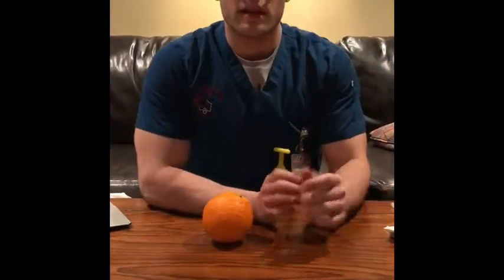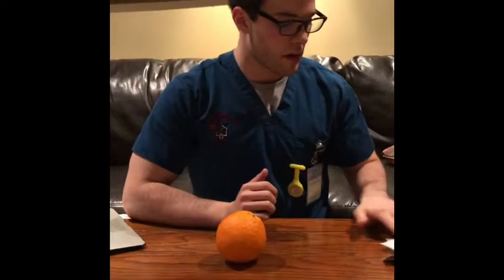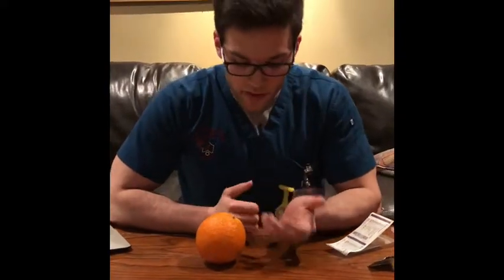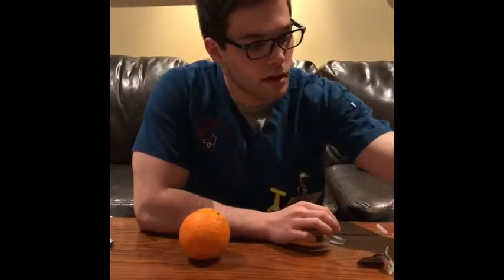But once again, I would do hand hygiene and put on gloves, and then I would start by coming into the room and then ensuring that the patient's ID matches up with whatever is written on the medication and what the MAR says, Mr. Mancini. And then from there, I would take my medication, and once again, based on patient build, decide which landmark to use. So for now we'll say deltoid, but if the patient had low muscle mass on their deltoids, we would more likely use the lateral aspect of the leg.